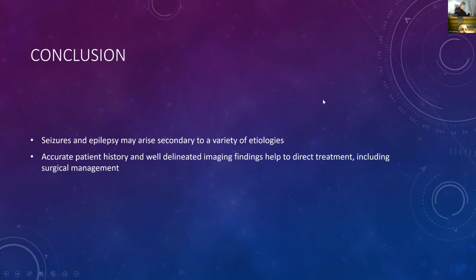Oh, thank you. So these are all the cases that you have met in your practice, yes? Well, these are just a selection of cases from different etiologies. So some representative findings from the different causes.